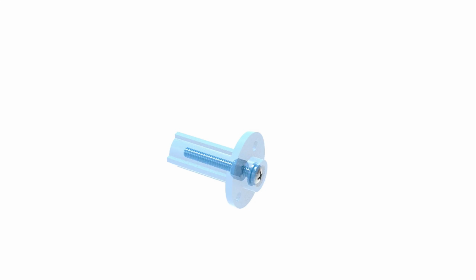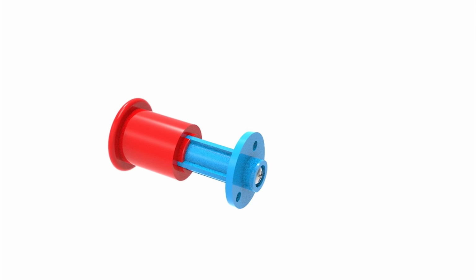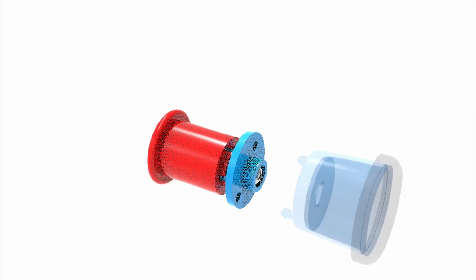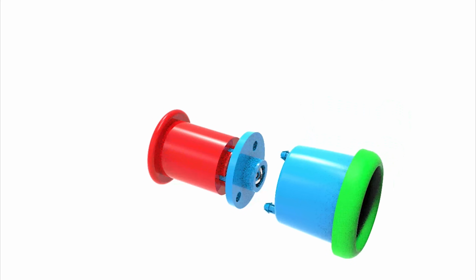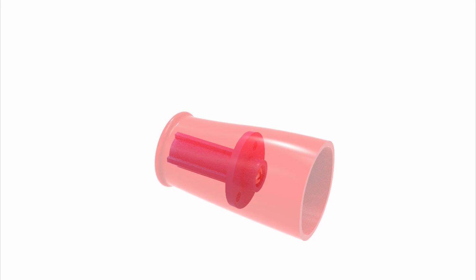Inside the extension insert is a bolt, split washer, and a self-locking nut. These parts fit securely inside the component. By rotating the bolt, it extends the wrist extension. The socket insert fits into the extension insert with removable snaps that allow for replacement sockets. The shell is attached by being ultrasonically welded to the extension insert.